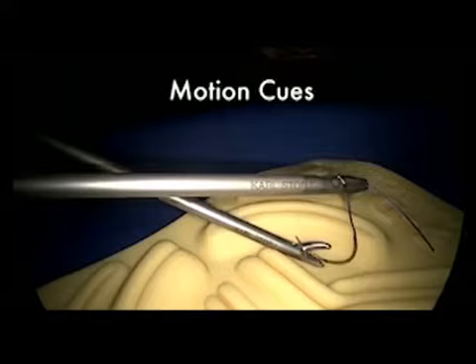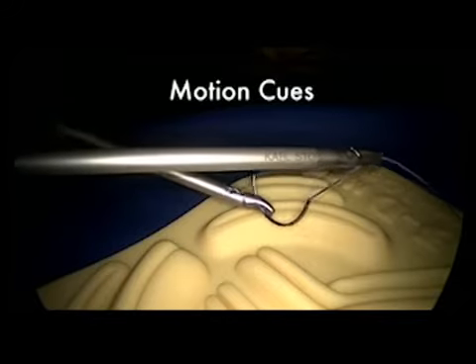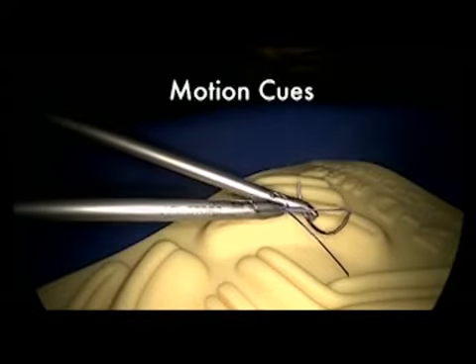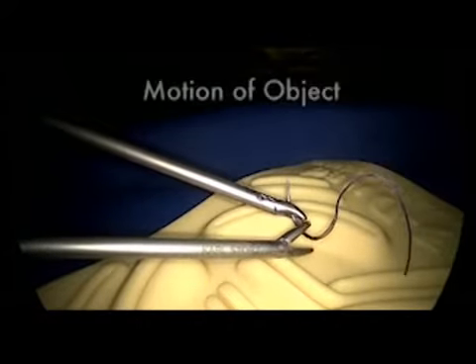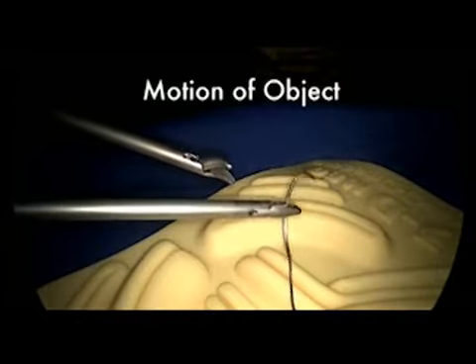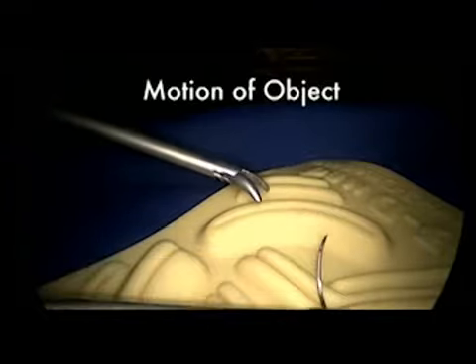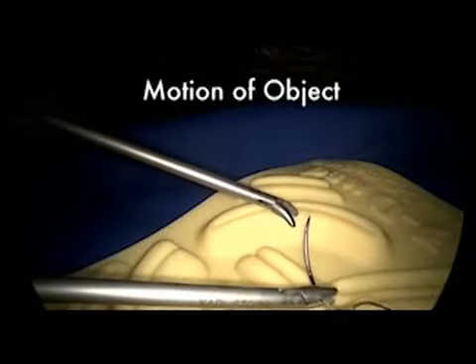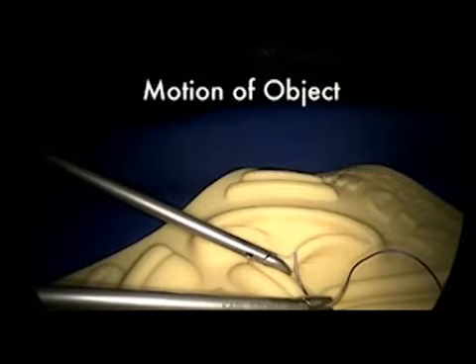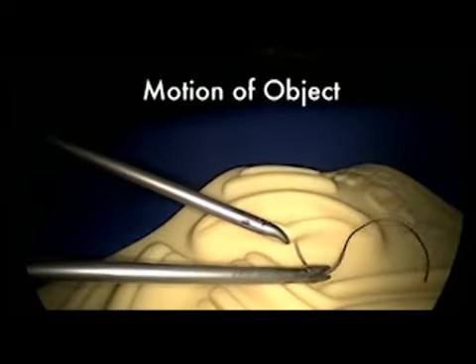Monocular cues from motion are vital to establishing depth perception in laparoscopic surgery, and may be from the motion of the object, observer, or from occlusion. Kinetic depth perception is determined by dynamically changing an object's position relative to a fixed observational point. If an object or plane is rotated, the visual angle is altered. These movements allow the observer to calculate depth.